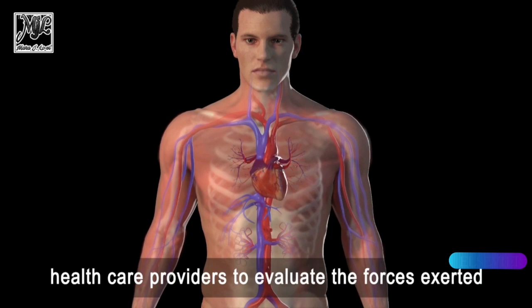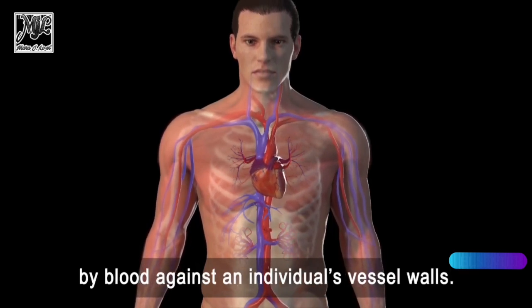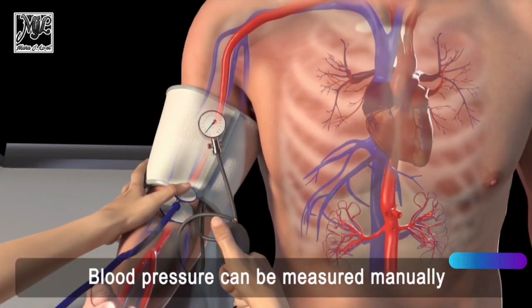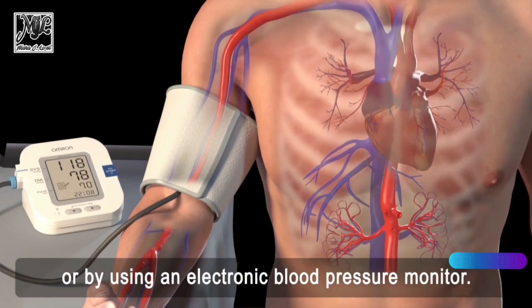Blood pressure measurement allows health care providers to evaluate the forces exerted by blood against an individual's vessel walls. Blood pressure can be measured manually or by using an electronic blood pressure monitor.